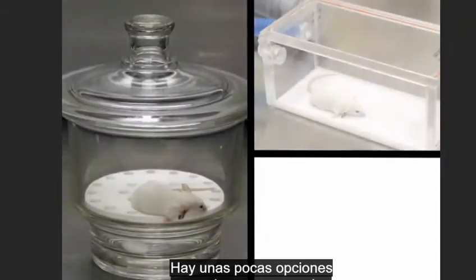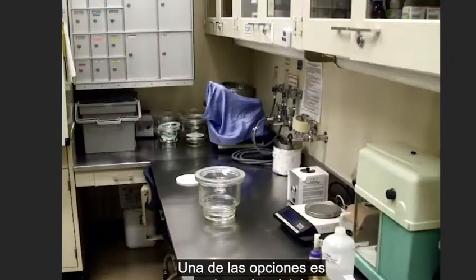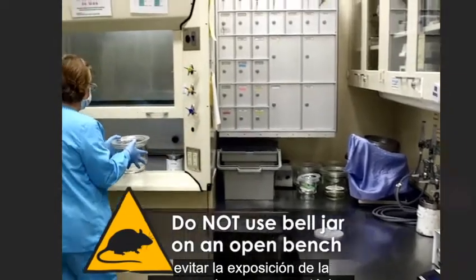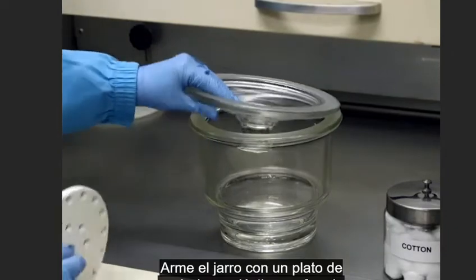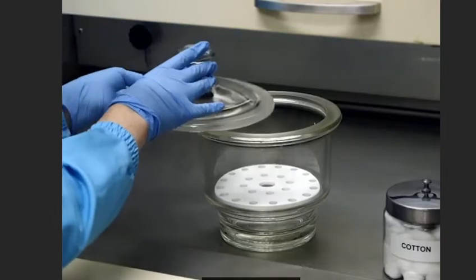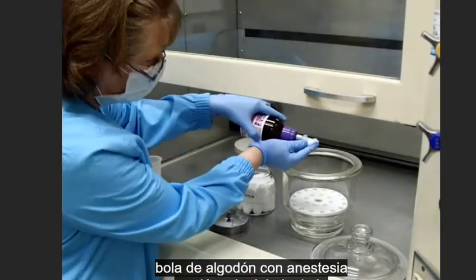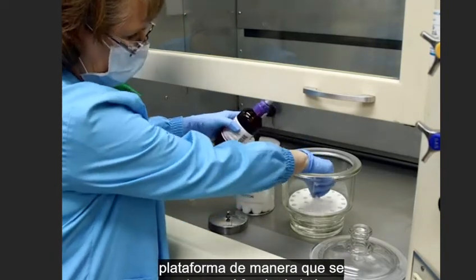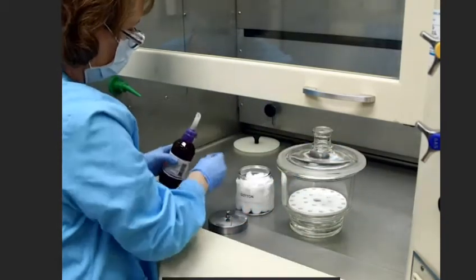There are a few options and equipment that one can choose from to administer inhalant anesthetics. One of the choices is a bell jar, which should be used under the hood and not on the bench to avoid personnel exposure to anesthetic gases. Assemble the jar with a ceramic or plastic perforated platform, creating a space between the bottom of the jar and the platform. While wearing impervious gloves, saturate a cotton ball with anesthetic and place it under the platform so that it rests at the bottom of the jar, then immediately secure the lid to prevent escape of the anesthetic vapor.